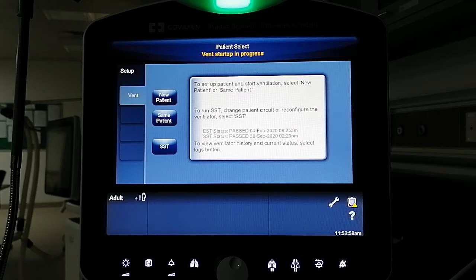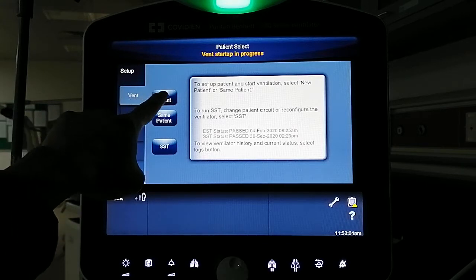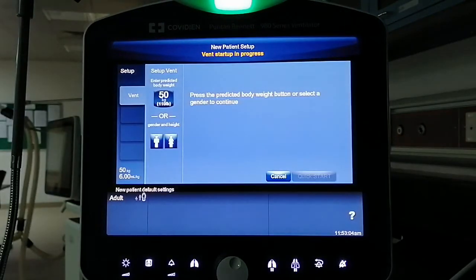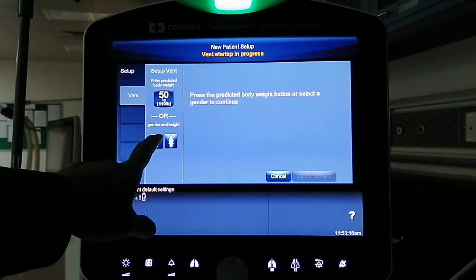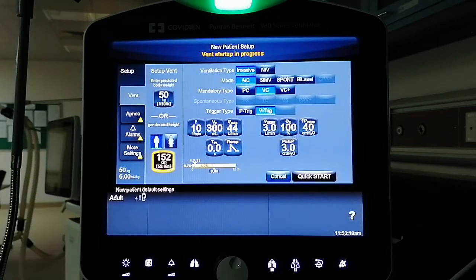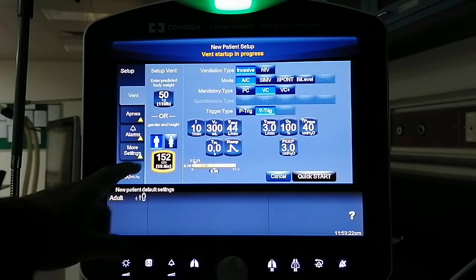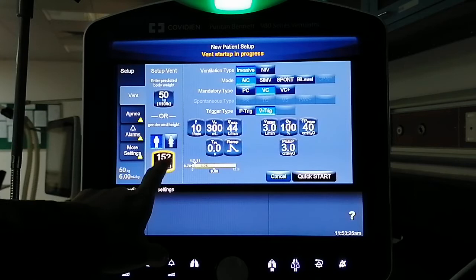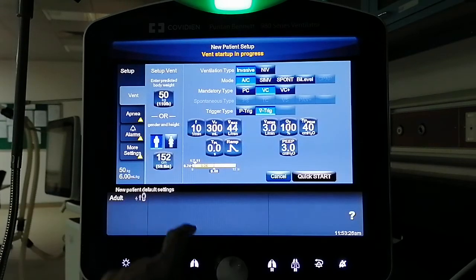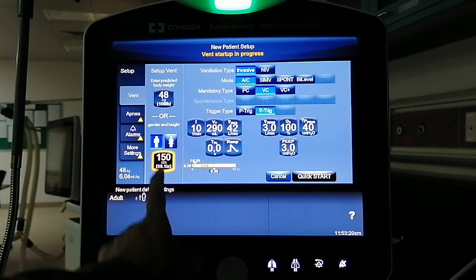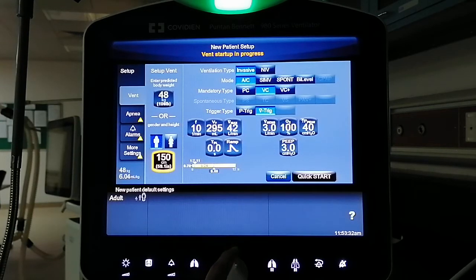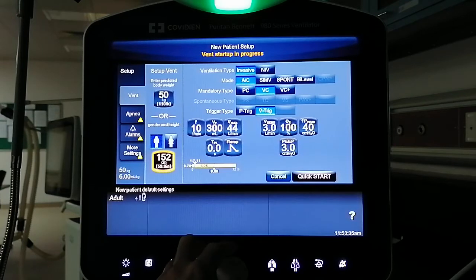All you need to do is select a new patient. Make sure that the ventilator is not connected to the test lung. You need to select the patient's gender, and then you can enter the patient's height. If it is highlighted yellow, that means it is active and you can increase or decrease it by using the knob.